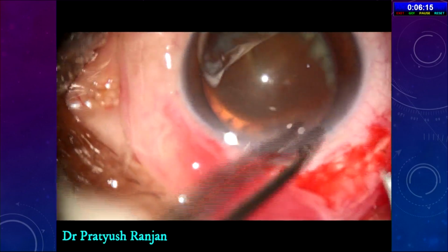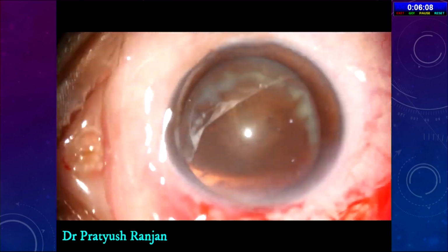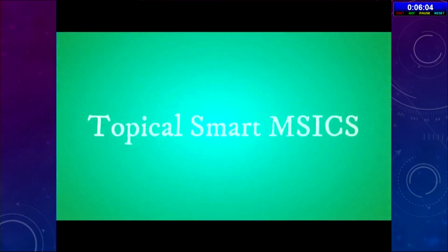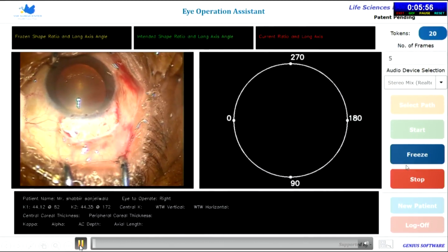So this is how a smart incision is made. At the end of this incision, the corneal mire should be perfectly circular. Now the doctor who was doing it has got a software, and with the help of the software you don't have to put the keratoscope again and again.